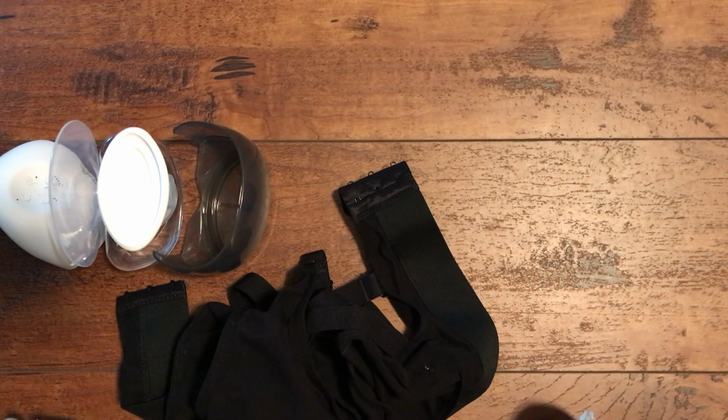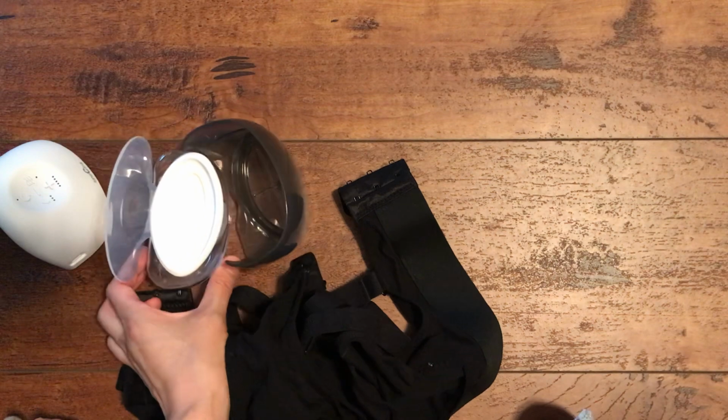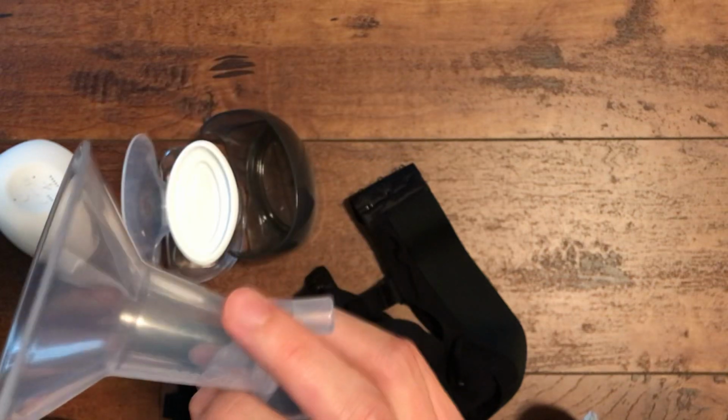But there were a few times when I've pumped for like 20 minutes and I check and I only get like a third of the output. So I was wondering why, and I think it's because I lost suction midway, and it's hard to tell. And that's one of the downsides about wearable bras, because you can't really check your progress like with a normal wearable or non-wearable pump.